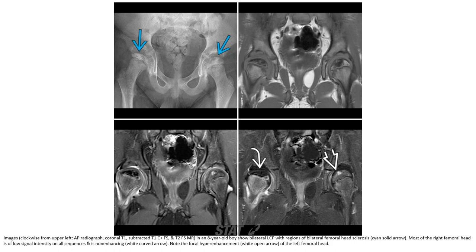Images clockwise from the left: AP radiograph, coronal T1, subtraction T1C+ FS, and T2 FS. This is an eight-year-old boy with bilateral disease. There is bilateral femoral head sclerosis. Most of the right femoral head is of low signal intensity on all sequences and non-enhancing. Note the peripheral rim hyperenhancement of the left femoral head.